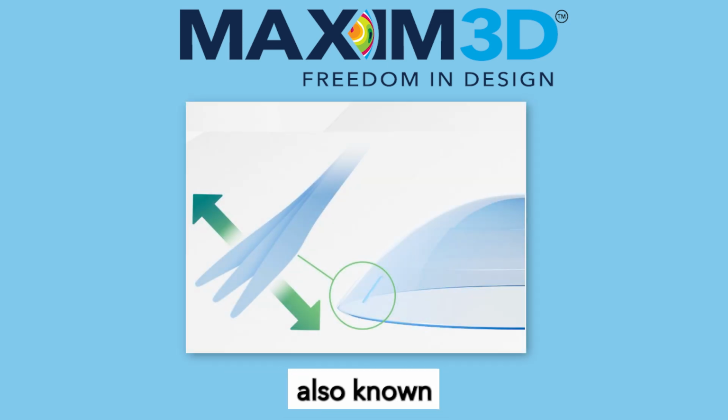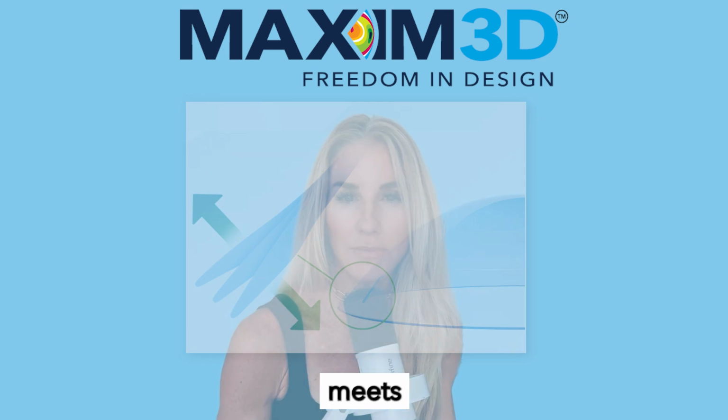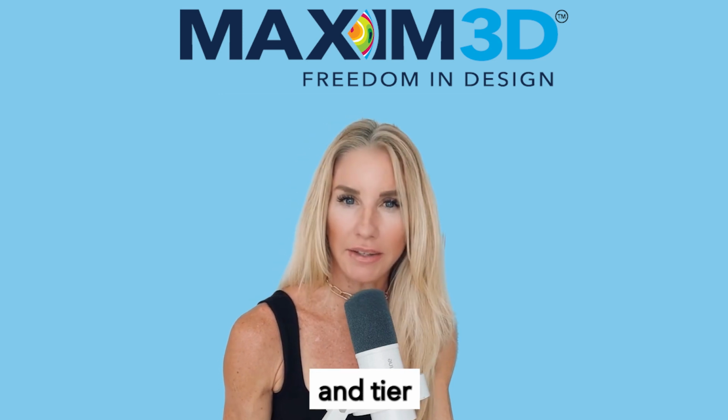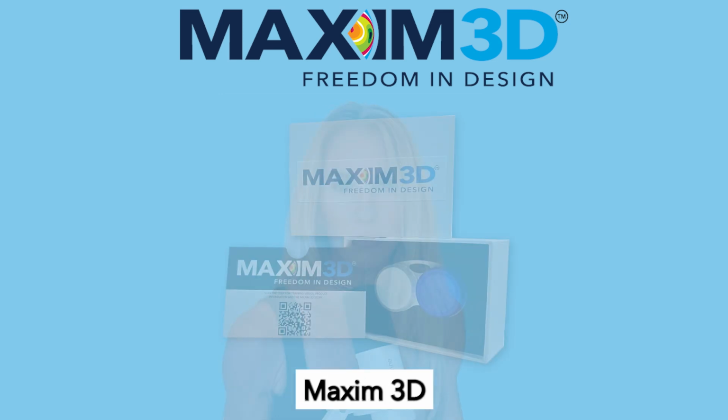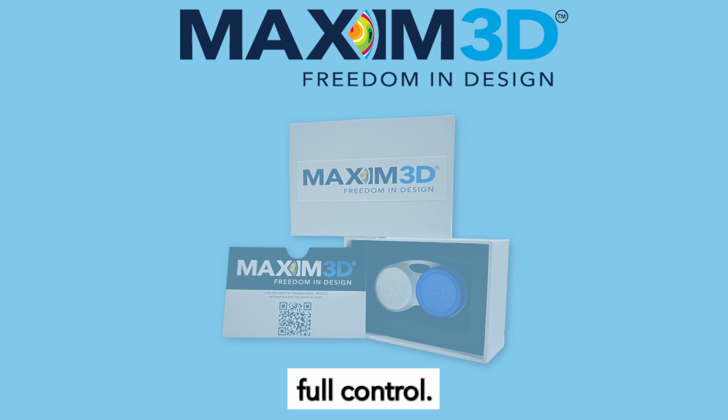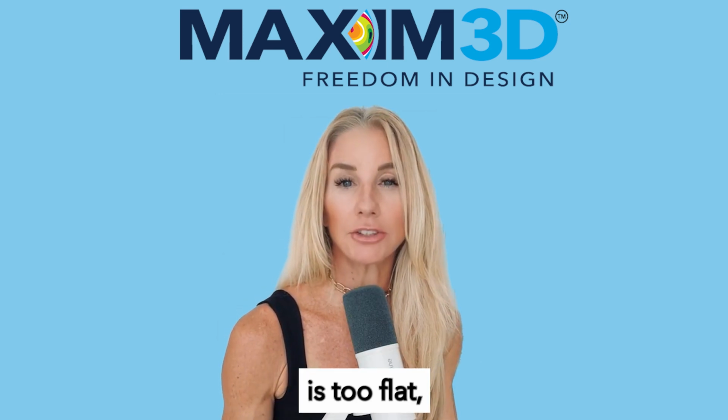The landing zone, also known as PC4, is the final curve that determines how the lens meets the sclera. It plays a major role in stability, comfort, and tear exchange. Maxim 3D allows you to modify this zone globally with toric geometry or through quadrant-specific and freeform shaping, giving you full control. These are the signs the landing is too flat.